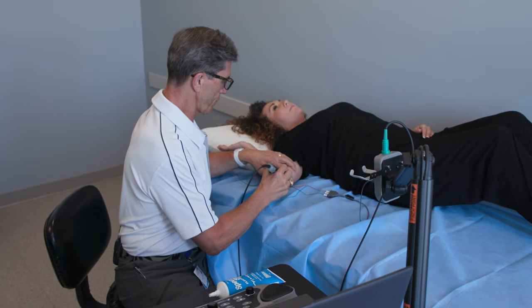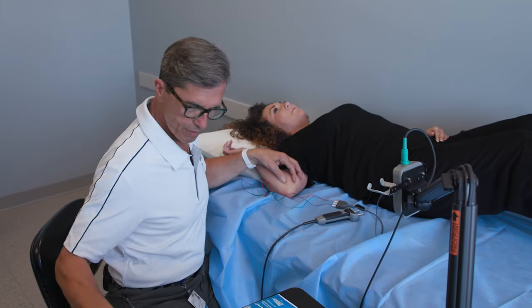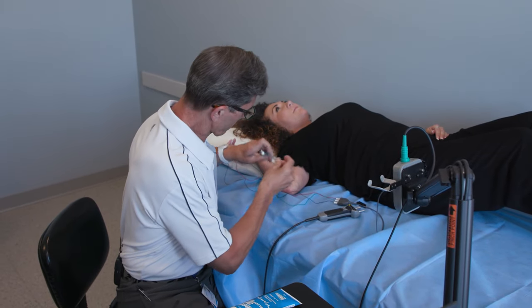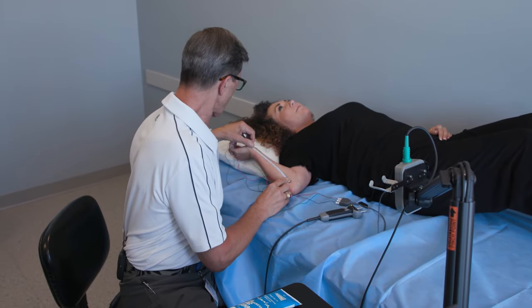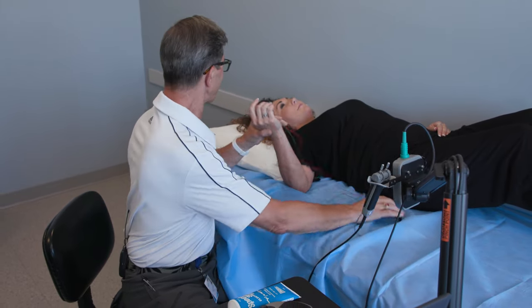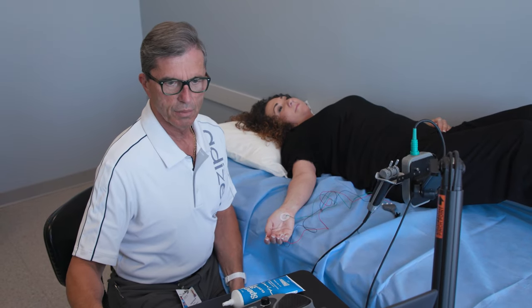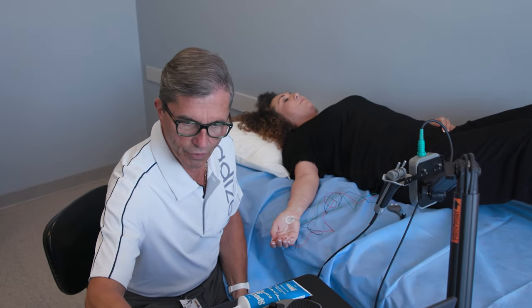Now we're going to do the same thing up here in your elbow. It feels a little bit stronger when we do it here. Perfect, that's good. Now we're going to take a measurement. 18-5 — that's perfect. Doing okay? If it's uncomfortable, just let me know. We're just going to plug that data in and we're going to move to a different finger.